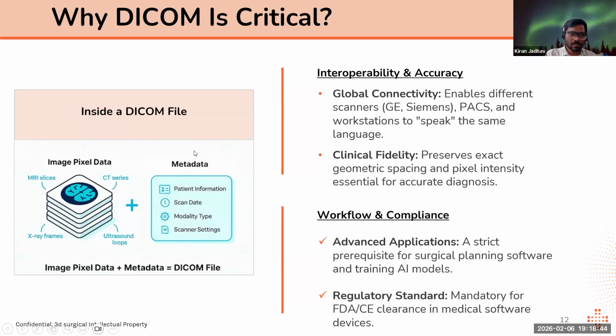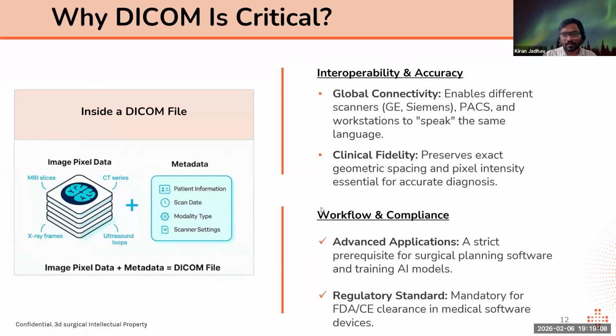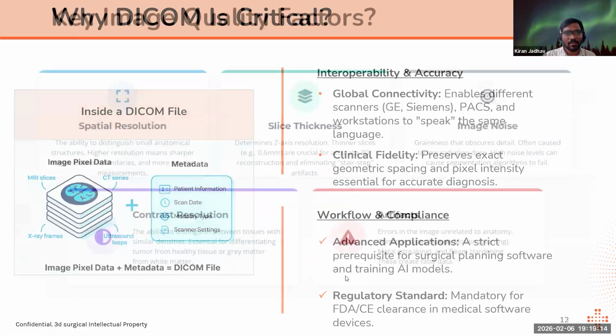So that is why these DICOM images are most important in medical imaging. We have talked about how the image is captured, how it is stored, and in which format it is stored. And there are a couple of factors associated that we have seen here, like the slice thickness, rows, pixel. All these are part of the DICOM tag information.